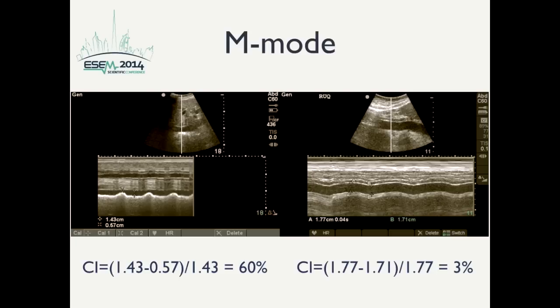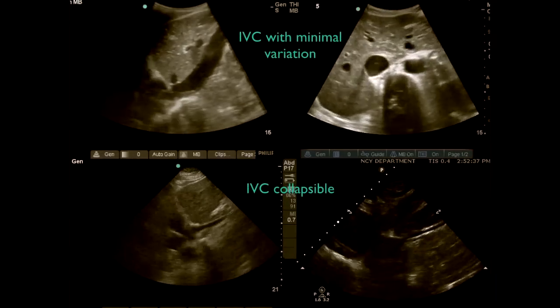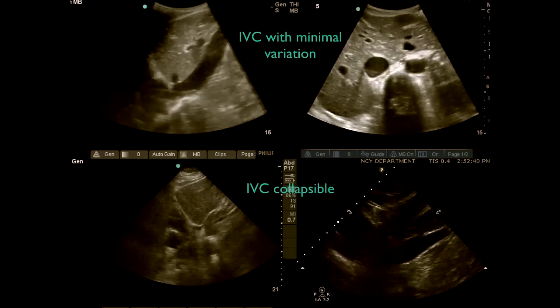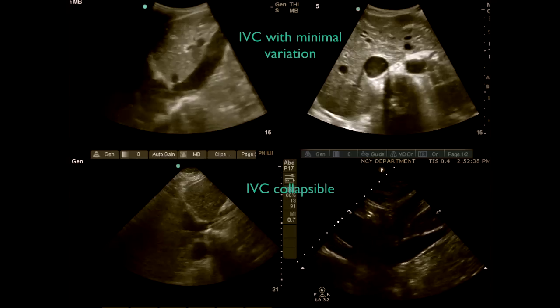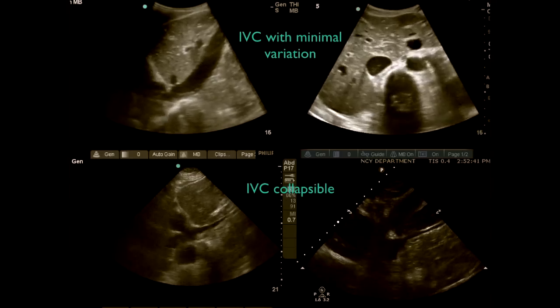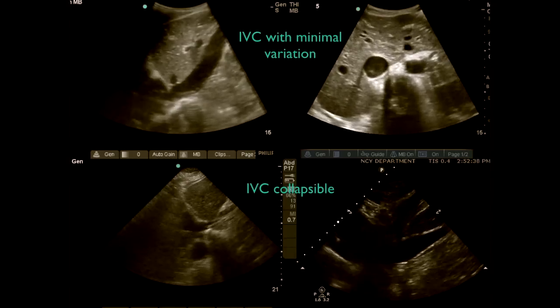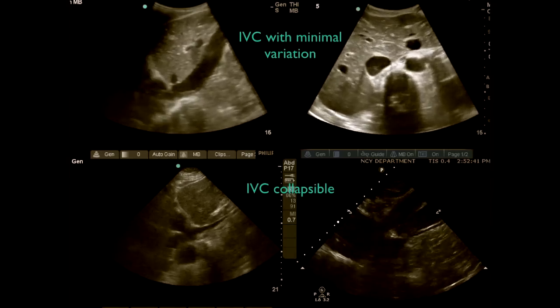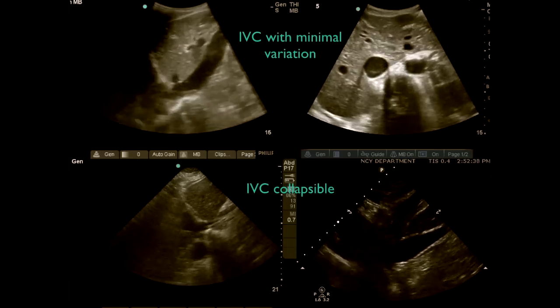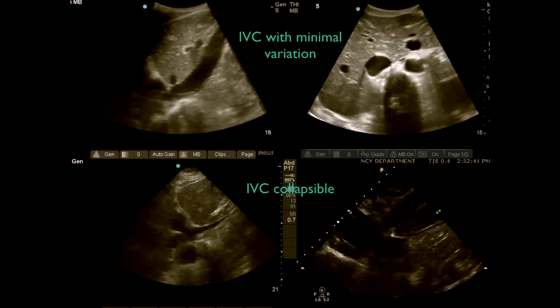You don't even need to measure and calculate exact numbers — just visually looking at the IVC on the M-mode graph, you can clearly see that the IVC is collapsible compared to a distended one. In the images at the top of the screen, the IVC is distended with minimal respiratory variation, while in the lower images the IVC is small and completely collapsed.